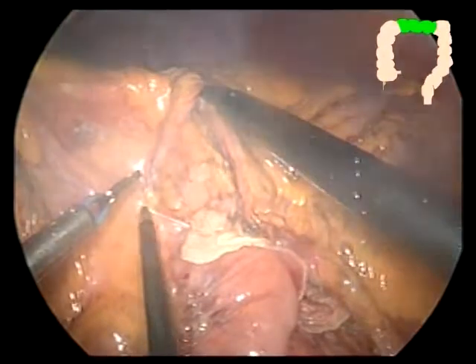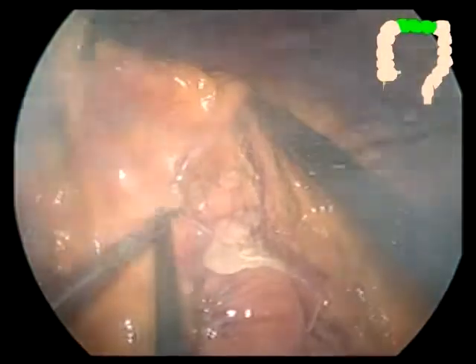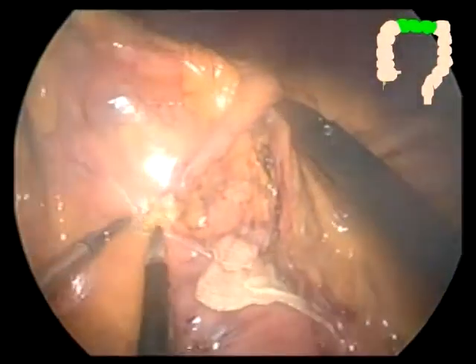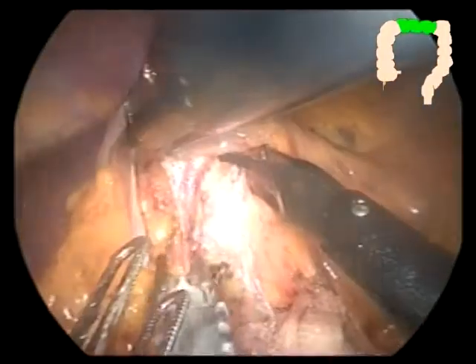Then the transverse mesocolon is dissected up to the middle colic pedicle, which is divided.